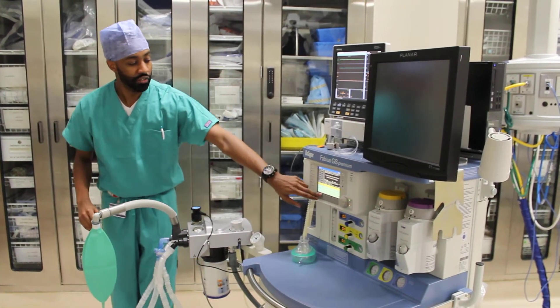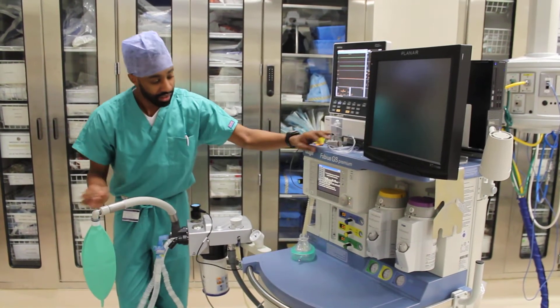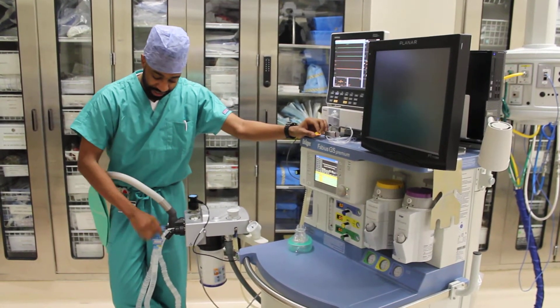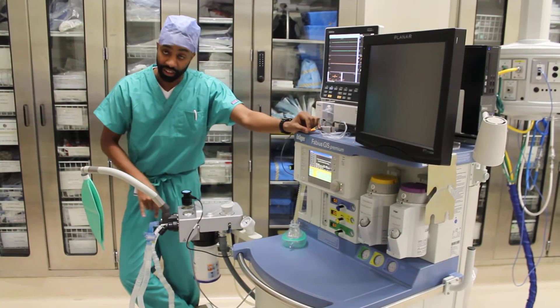Our next step is to check our flow sensor and calibrate that. In order to do that we must expose our expiration hose to air and start our flow sensor calibration. I know that this is the expiration hose because it's labeled here, as well as the arrow is pointing back into the machine. Our inspiration hose is also labeled and there's an arrow pointing out.